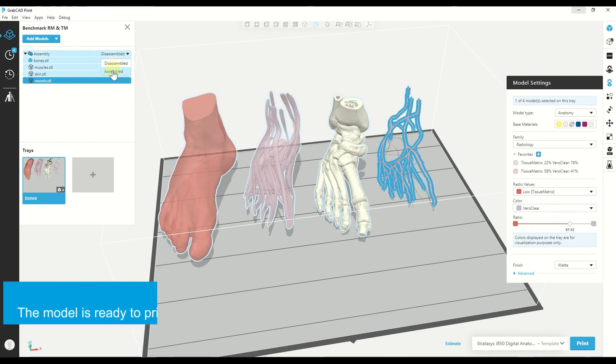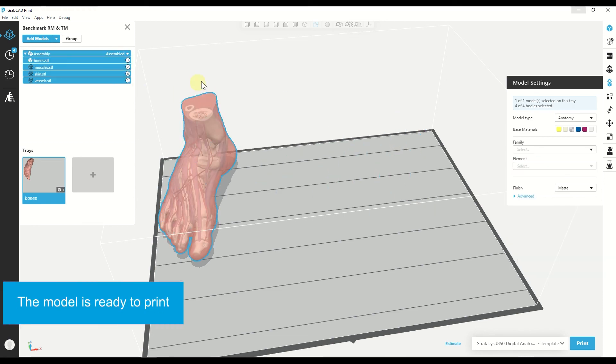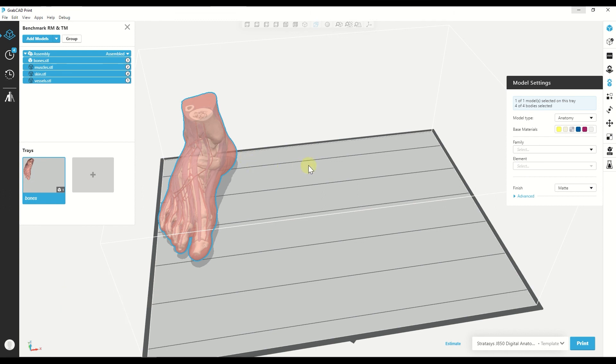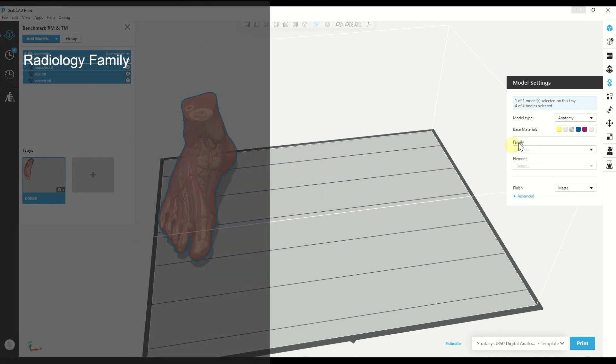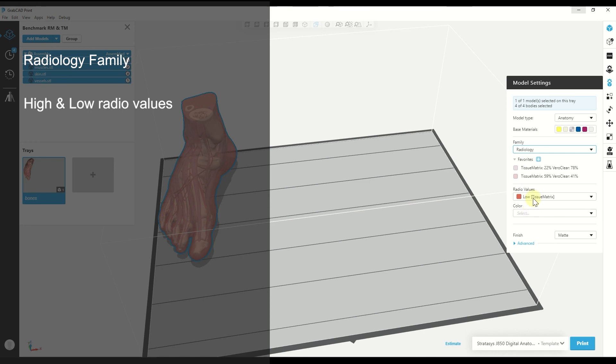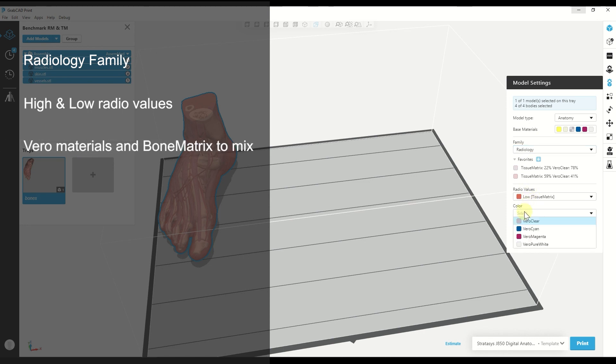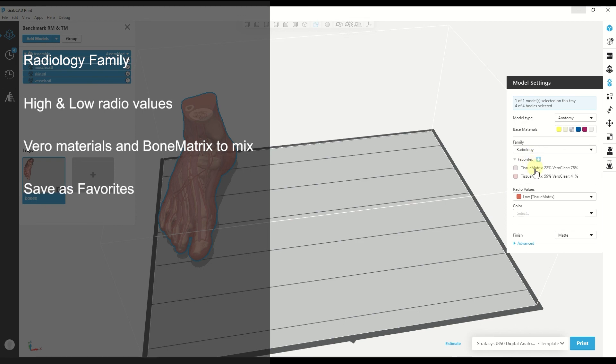And that's it. Now we can print the model. So we learned about the radiology family. We have two radio values that we can choose from, the high and the low, and the different materials that we can mix it with, which are the Vero materials and bone matrix. We also have the favorites that we can save a material mixture that we like and use it for later.